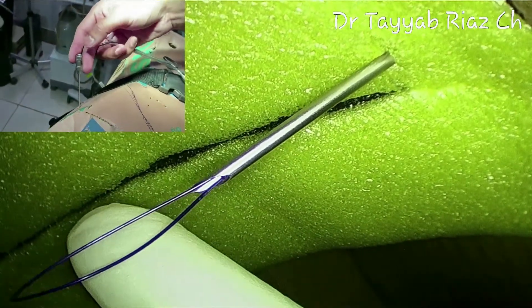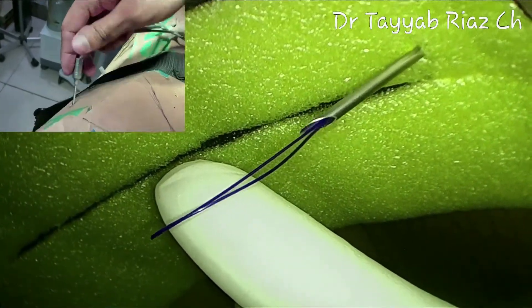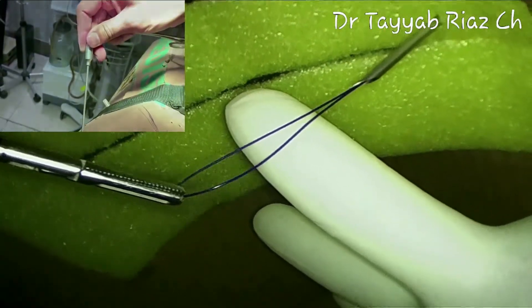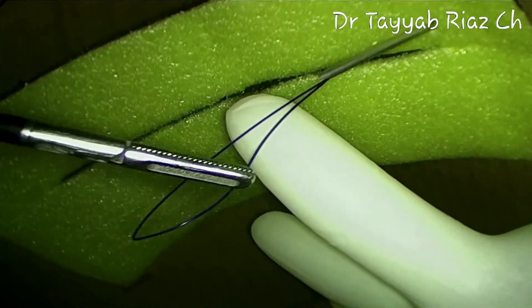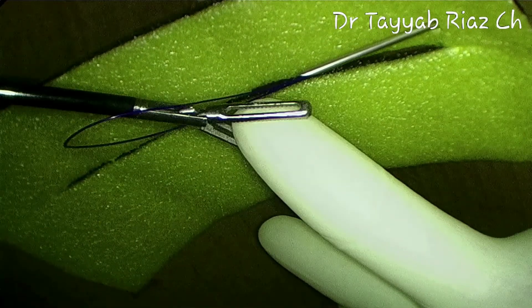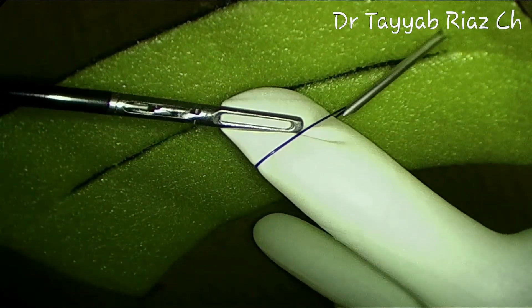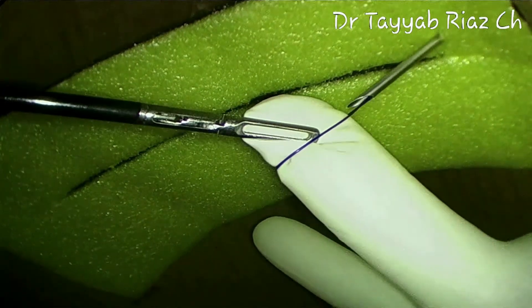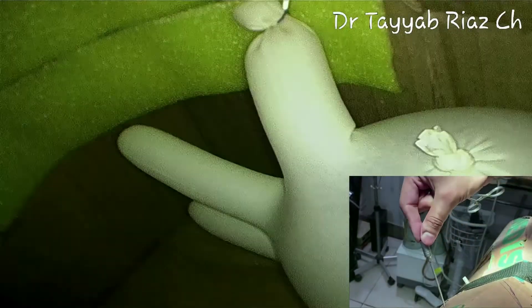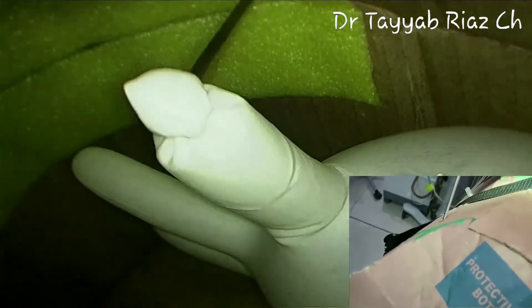Feed some extra length of the loop inside the peritoneal cavity, then with the help of the grasper pull the loop further inside as desired. Going through that loop, hold the tip of the appendix with the grasper and slide that loop over the tip of the appendix with the help of the Veress needle and the grasper. Then tighten the loop by pulling it outside. Check out the freedom of movement — you can manipulate the tip of the appendix in any direction easily.